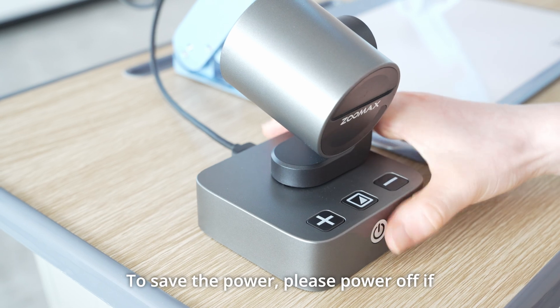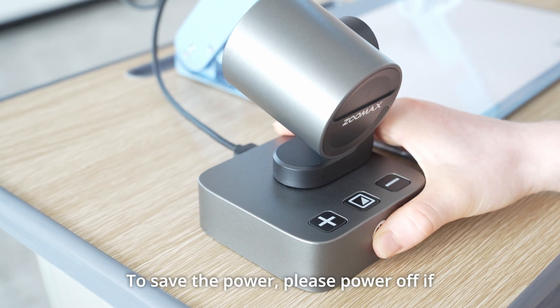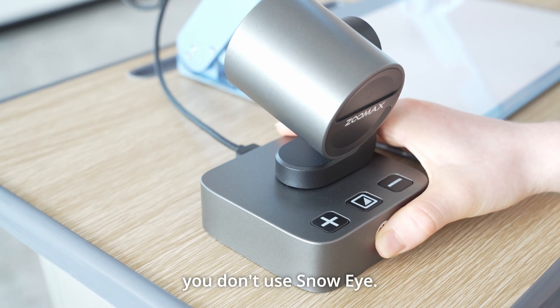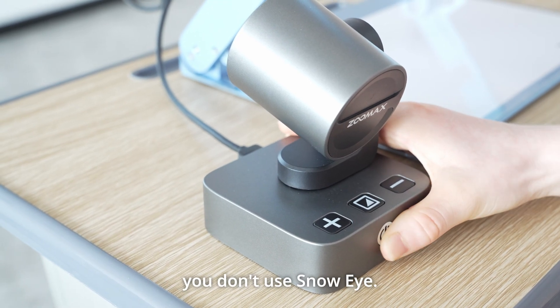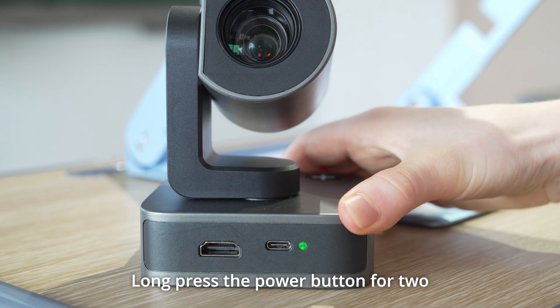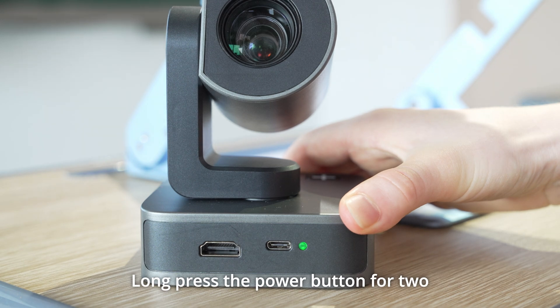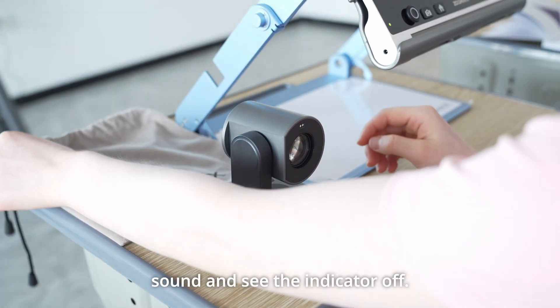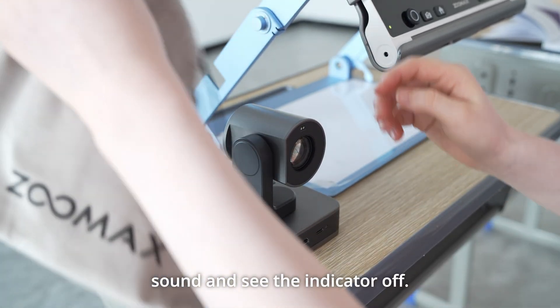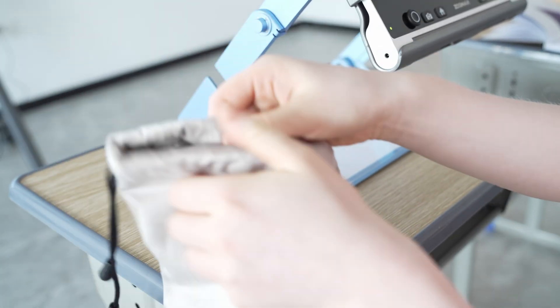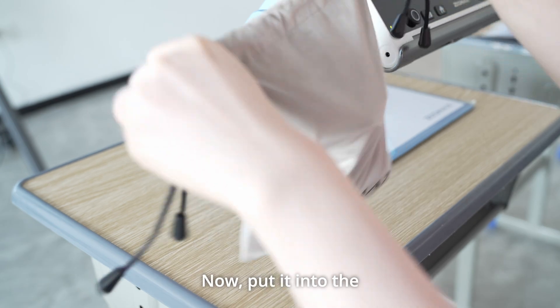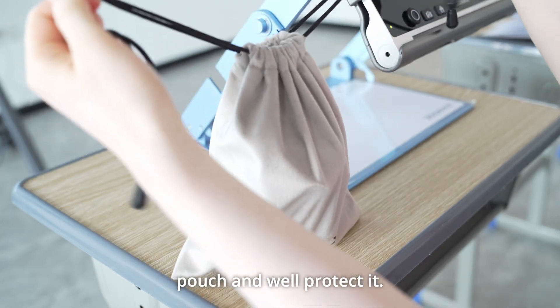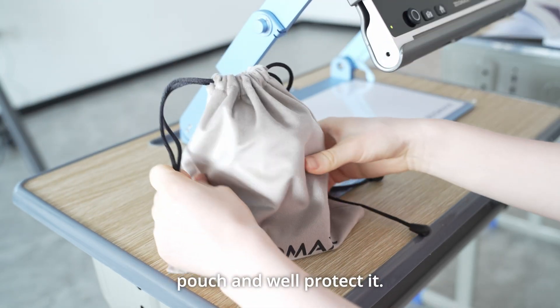To save the power, please power off if you don't use Snow Eye. Long press the power button for 2 seconds, you hear the beep sound and see the indicator off. Now, put it into the pouch and well protect it.